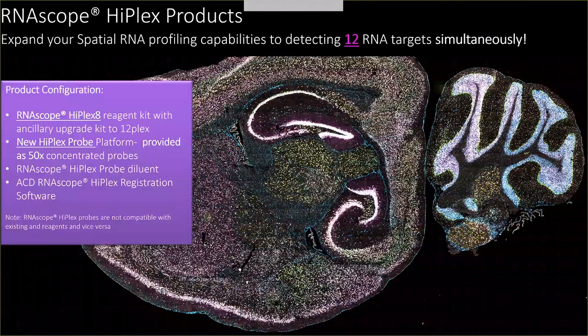This is our new product where we have a base HyPlex 8 kit which can be upgraded to detection of 12 targets simultaneously. We also have new HyPlex specific probes which are required to amplify 12 targets simultaneously. This assay also requires an RNAscope HyPlex specific probe diluent as well as image registration software.